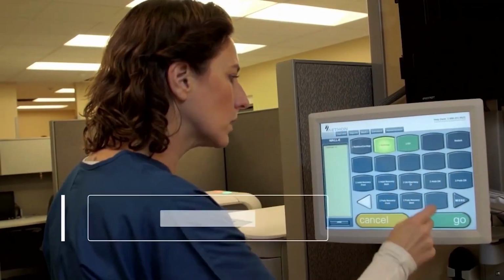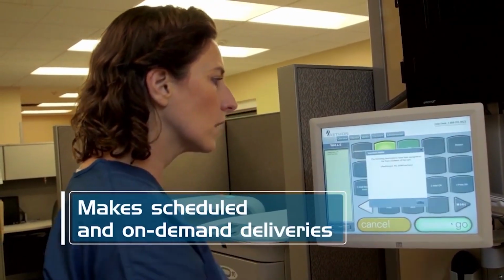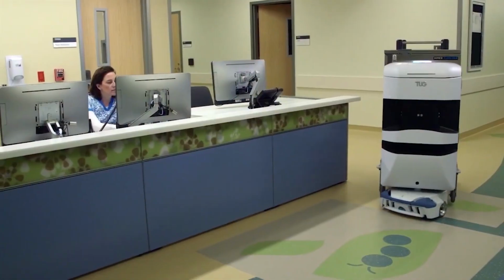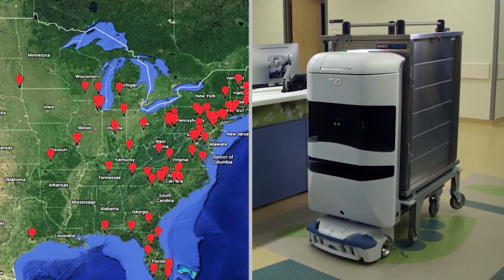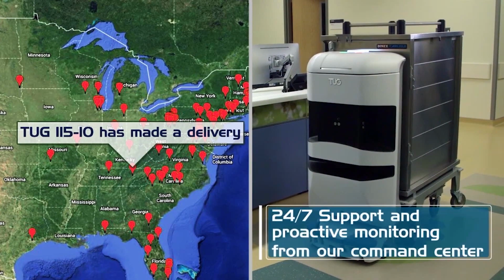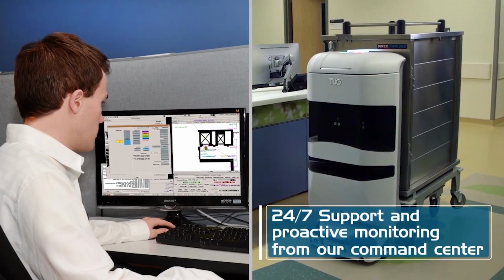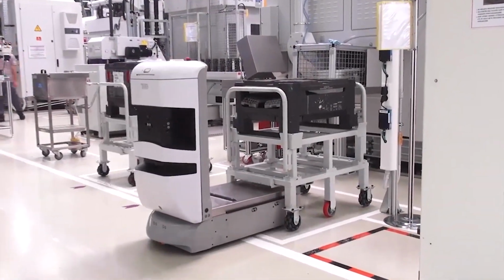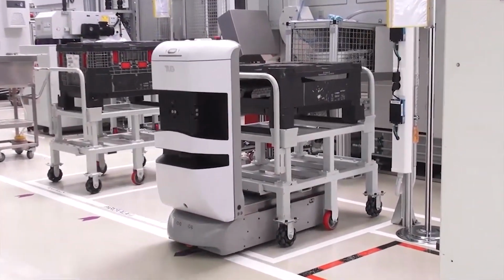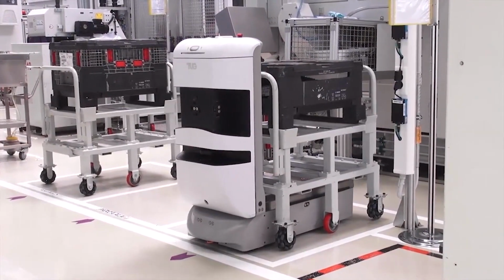To enhance its transportation operations, the San Francisco Medical Center at Mission Bay installed 25 Tug robots when it first opened in 2015. The robots have sensors to make sure they don't collide with anything on their journey to the lab and are programmed with the hospital's floor plan. They also politely request that people move to the side as they enter crowded hallways.